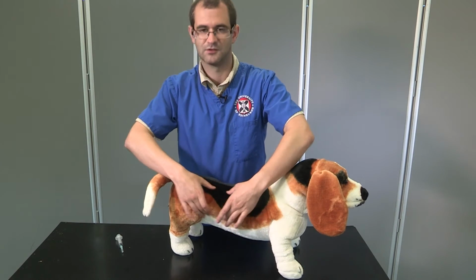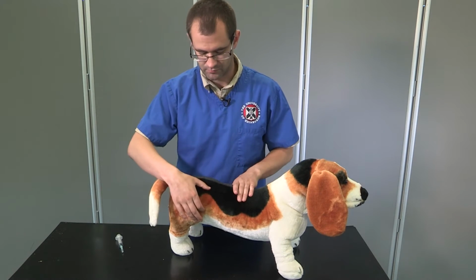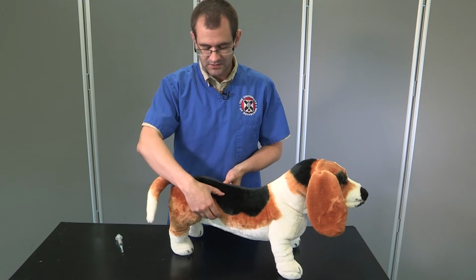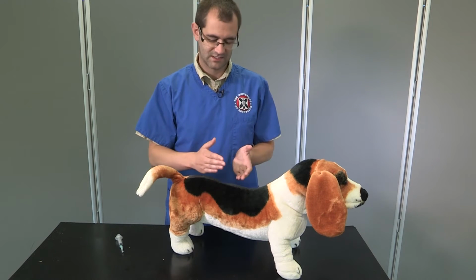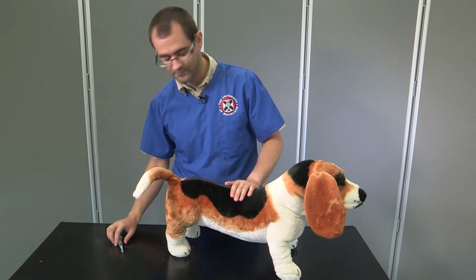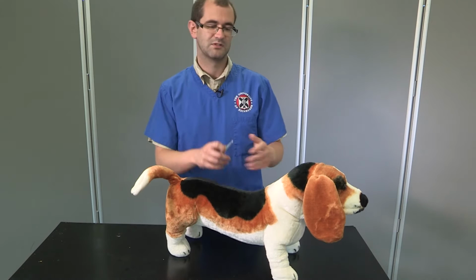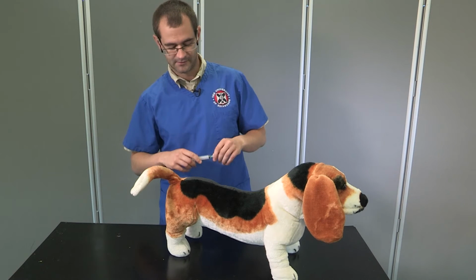For the lumbar musculature, the landmarks for this are caudal to the last rib, and we have a muscle belly here that you can see quite clearly on some dogs and also some cats. In cats it's generally more difficult to find. They tend to be a bit slimmer and not have quite as much musculature back here. For this one again, you need pretty good restraint. The dog's head can move around and get you if you're not careful.